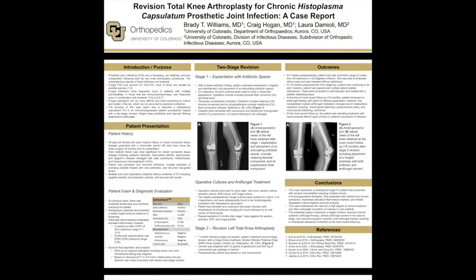At this time, she is infection-free and remains on suppressive antifungal therapy. However, this has necessitated multiple changes in medication due to adverse reactions. At the most recent follow-up, she was tolerating treatment with isavuconazole without signs of systemic or local recurrence. In Figure 2, we see anteroposterior and lateral radiographs of the stage 2 construct, including the hinged knee prosthesis that was cemented with both antifungal and antibiotic cement.